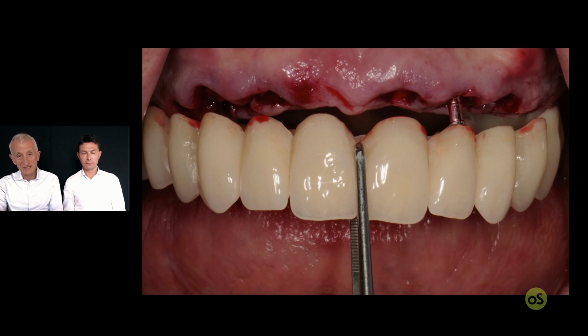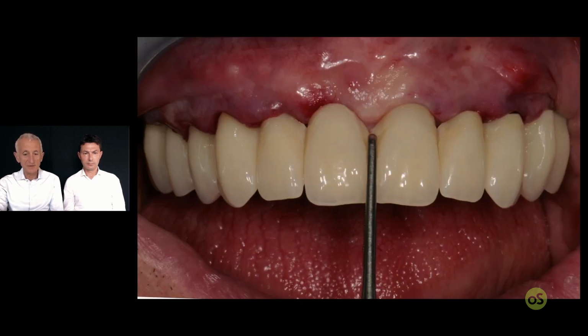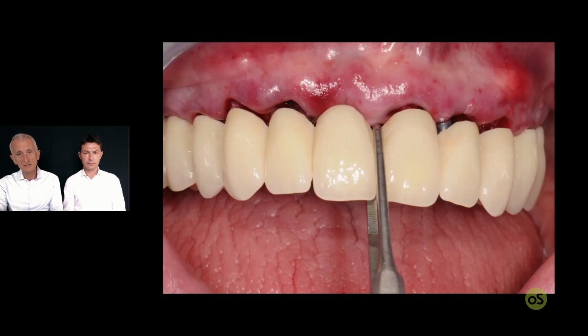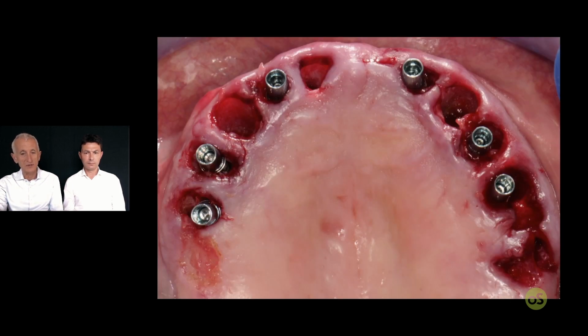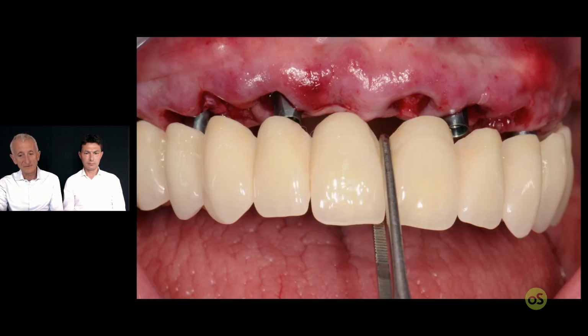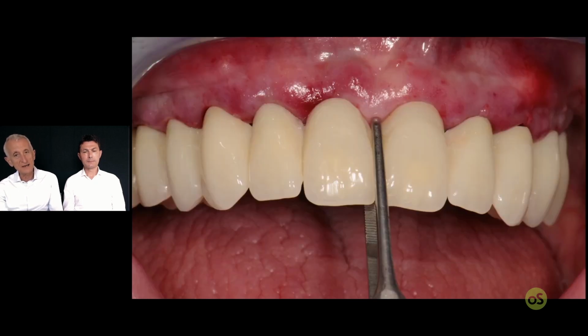do whatever is necessary, and use the shell as your intraoral guide. Every time you put an implant, you check with the shell and be sure that you are going in the right direction until you have placed all of them, and always use the shell to check this completely, okay? So the shell can really help you. That is why it's so important that it's correctly made.